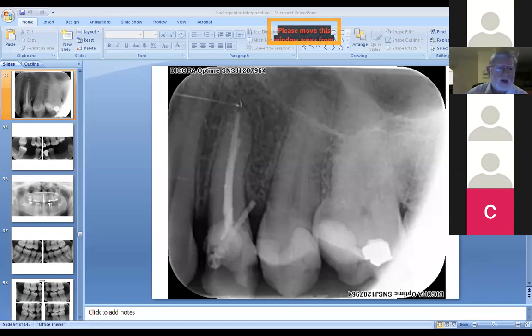Okay, so in the case where the crown is present, there's deep cemental caries extending subgingivally. You will try to prise the crown off in the hope that you can reuse it. It's not going to be fitting anywhere near like before, so that's a no-no. Removing the caries, cutting through the crown to get at the decay, is step 1.